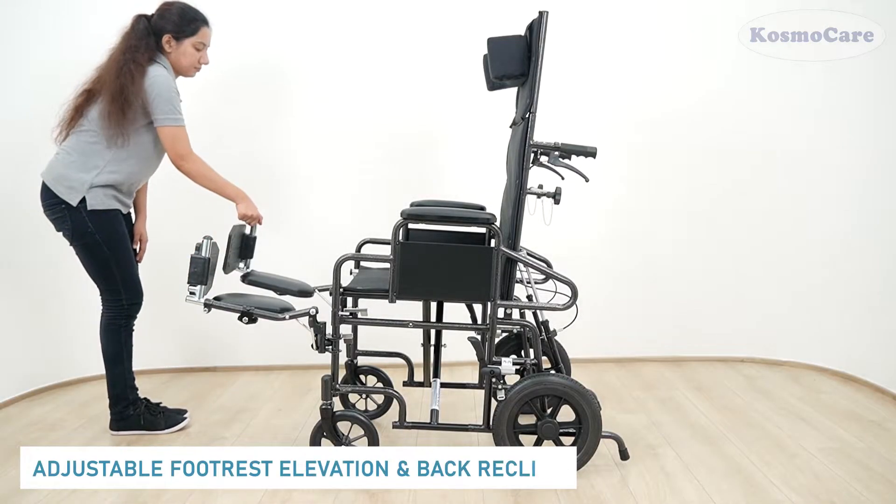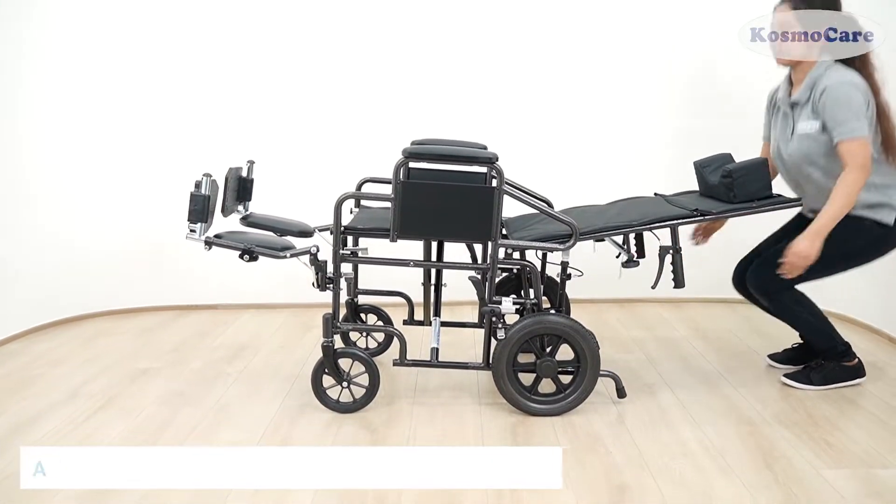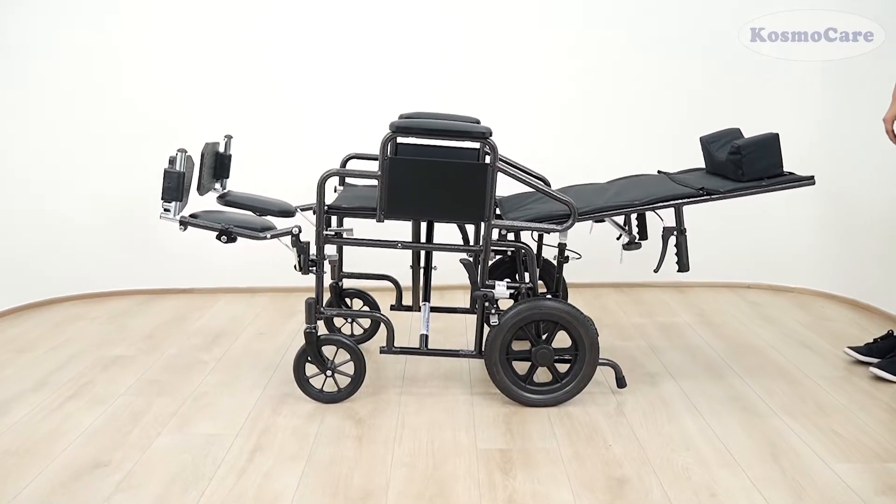Adjust the footrest elevation and back recline at multiple levels as per the user's convenience. This change in position helps reduce pressure on the back.